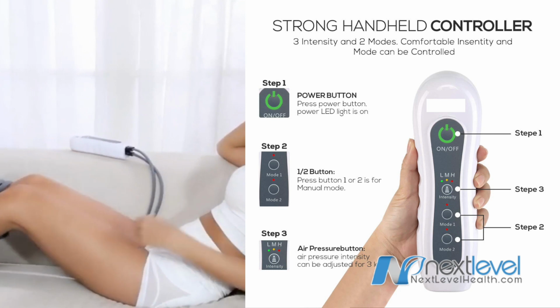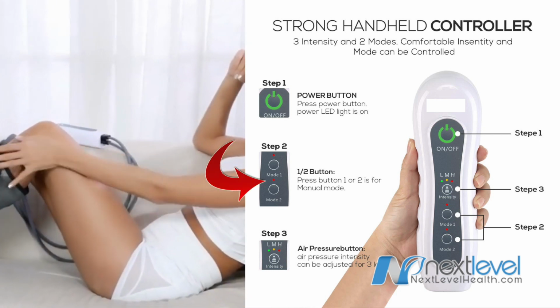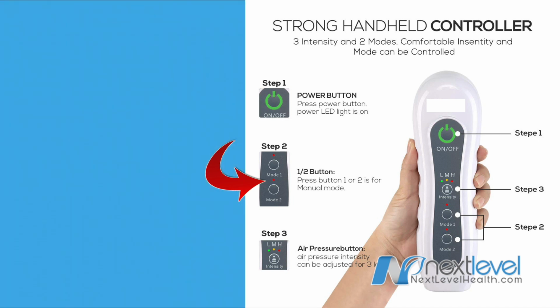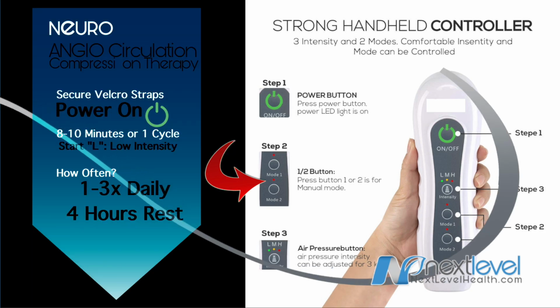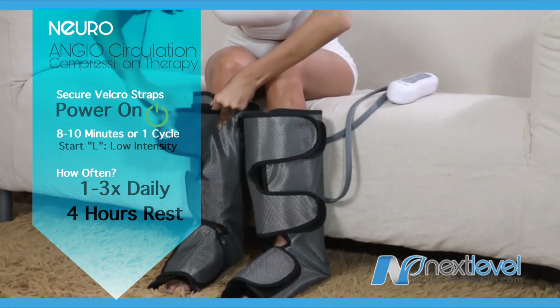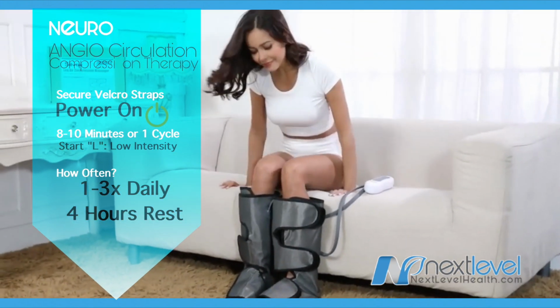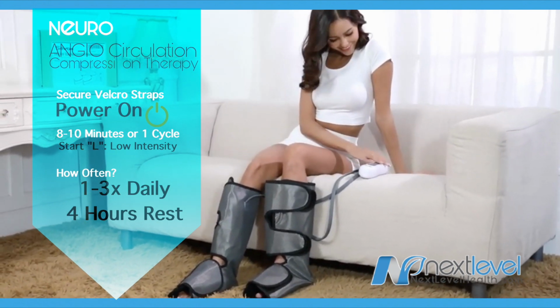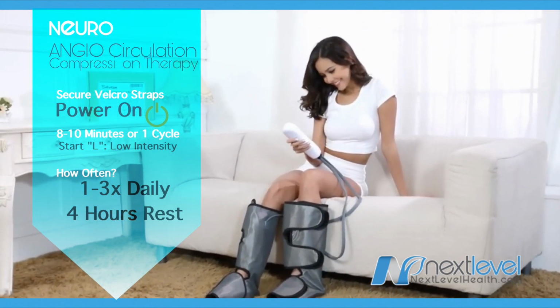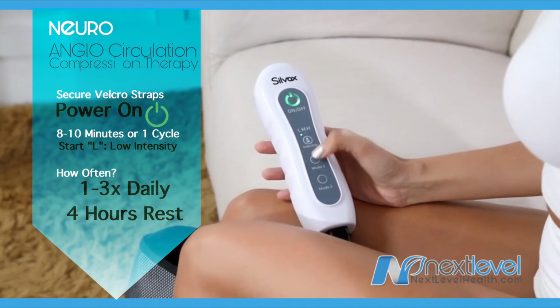And with the versions we use, there's typically a couple different types, various forms of the circulatory compression massage. Which mode it's in will dictate that. So play with what you feel comfortable with. And my suggestion is that you do this for a minimum of 8 to 10 minutes or one full cycle.